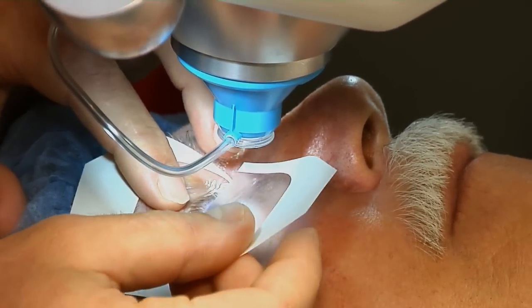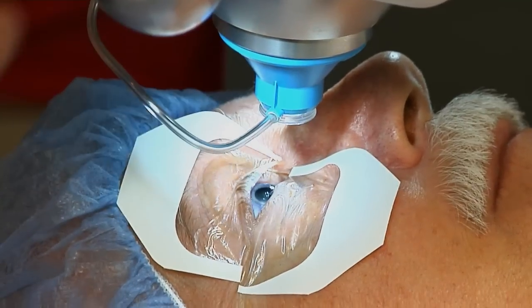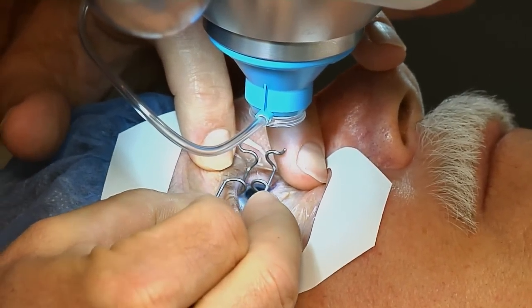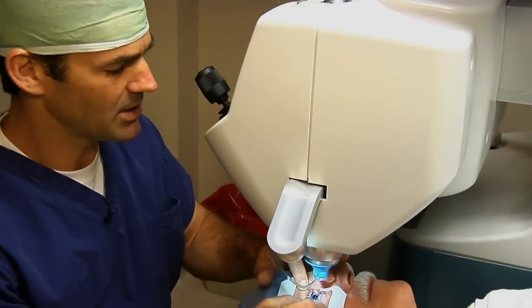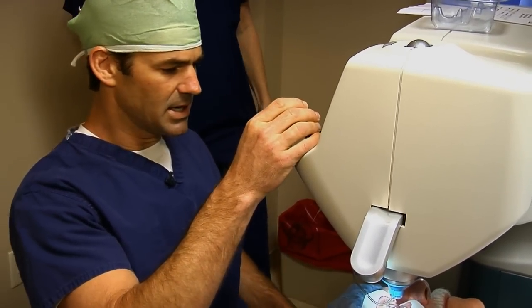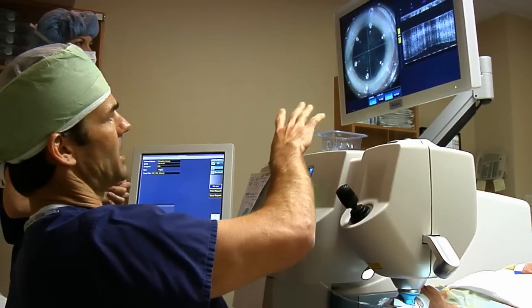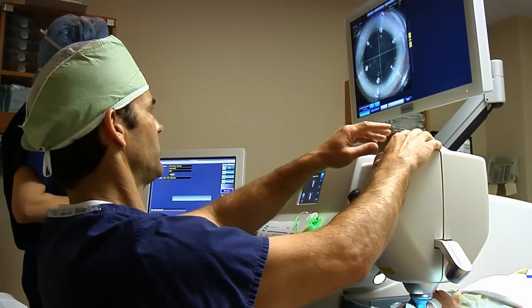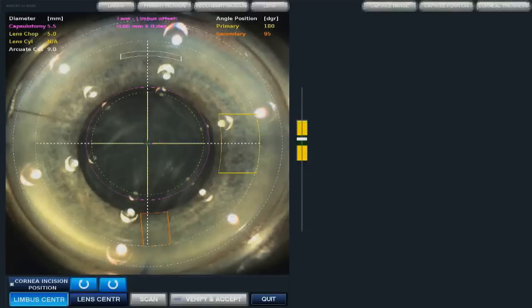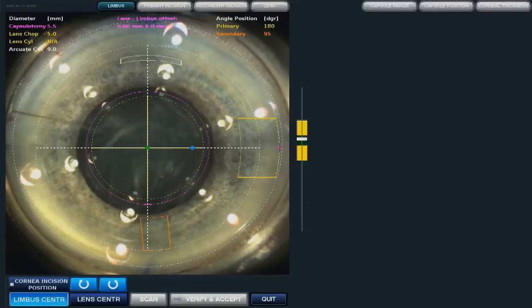FemtoSecond laser technology is a pretty amazing technology. It allows us to do more than we used to be able to with lasers. There are a couple of different applications currently available. The one we're looking at today is the LensX laser. So we have applanation — pressure on. Now we've engaged the eye, as you can see, and our treatments are overlying. We can move things around and put them exactly how we want them. I can move the wound — as you can see, you can scroll and put the wound wherever you want.